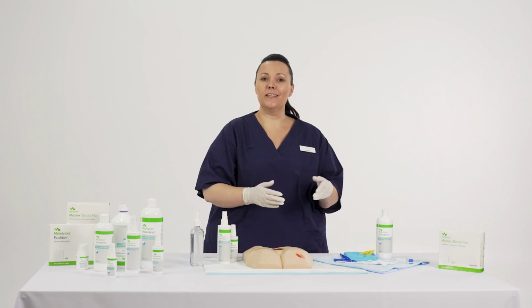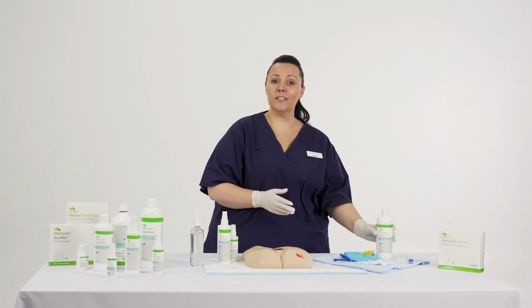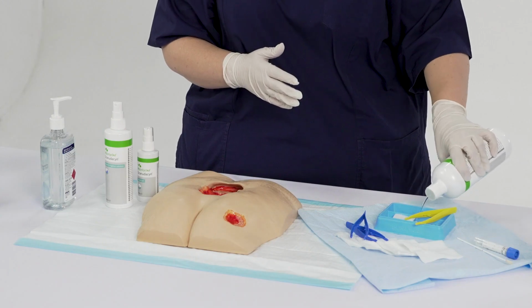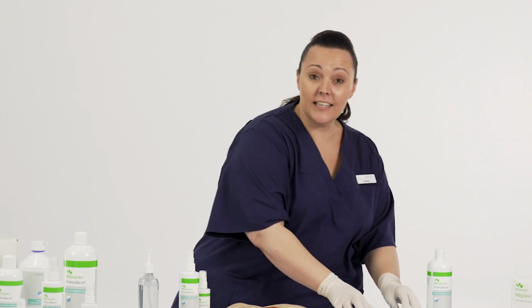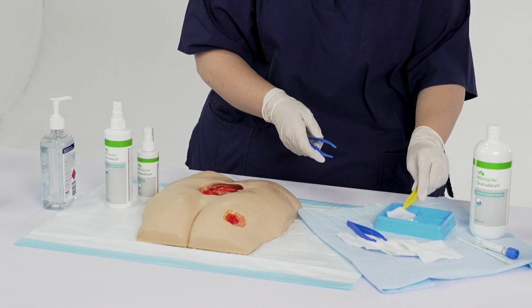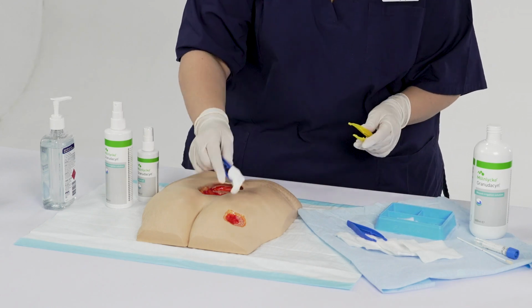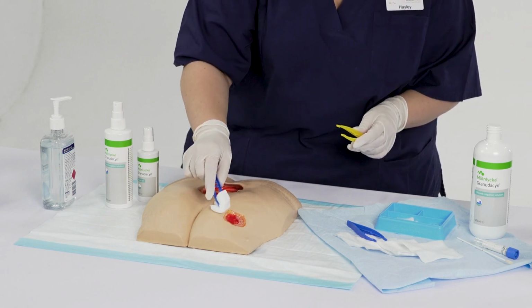I'm going to demonstrate this by using the non-touch technique. First, I'm going to moisten some gauze using the Granudacyn solution. I will then gently clean my wound bed. To do this, it's important to go from the inside out so that you're not cross-contaminating that wound.